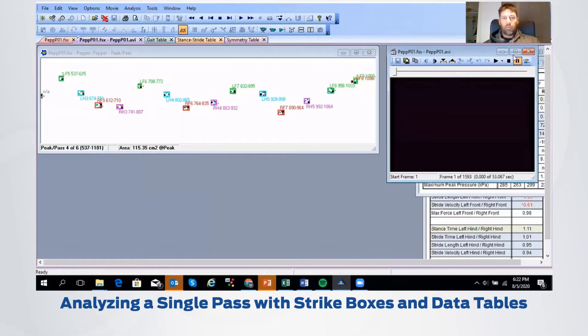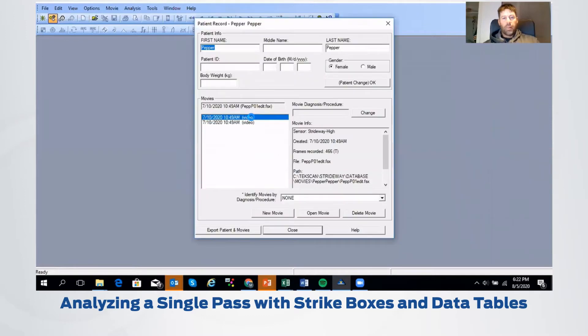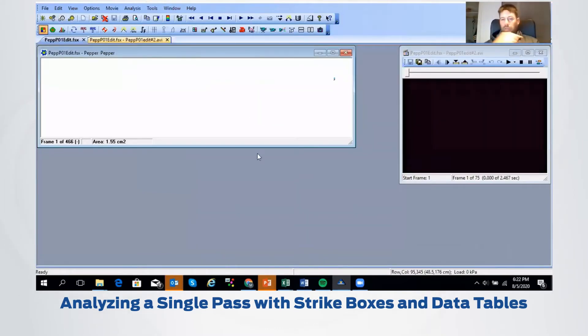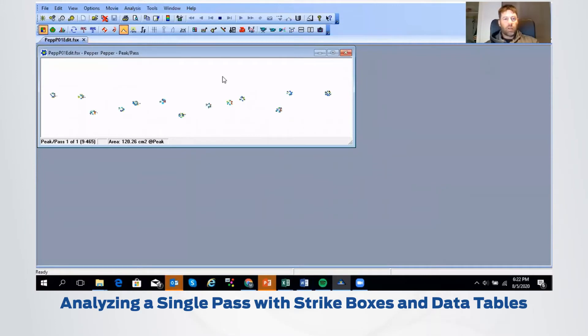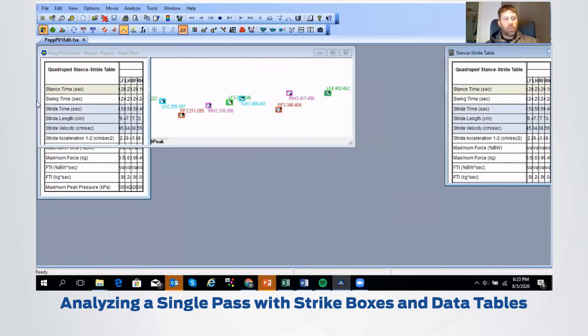We've done multiple passes. I've essentially just edited the video into one pass that I really wanted to focus on. As you know, if you've used things like this with animals, it does take a bit of a habituation period — you have to pass the dog, or the cat, or whatever animal you might be using, a number of times just to get them used to walking there and get some good data. So now if we just go and place this into peak mode, we'll be able to see the foot strikes. I'm going to take the video away since we've already identified everything. To get the strike boxes placed, we're just going to use the quadruped box up here and say yes to creating those boxes.